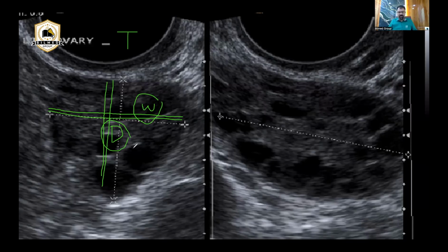Machine is obeying your commands because you have pressed a volume button. That is why 3 measurements will pop up. Now the machine is waiting for 3 measurements. Machine is not seeing whether you are taking it rightly or it can be wrong also. So by giving these 2 measurements, the machine is taking for granted that you have given the width and the depth in the given case.